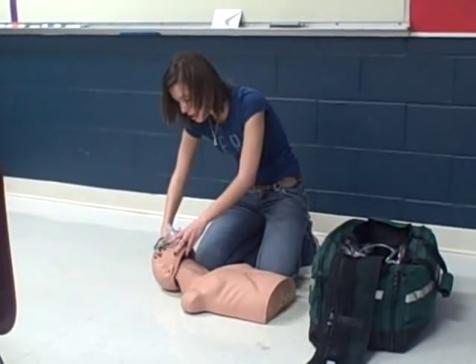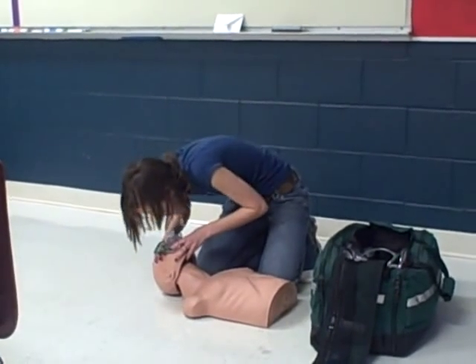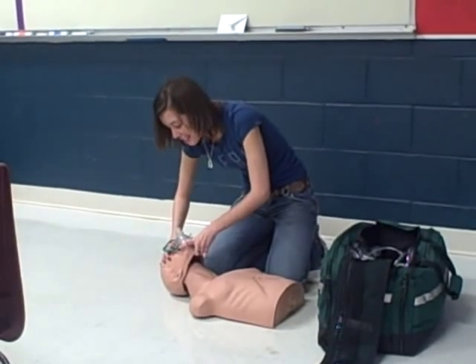2-1000, 3-1000, 4-1000, 5-1000, 6-1000. 2-1000, 3-1000, 4-1000, 5-1000.